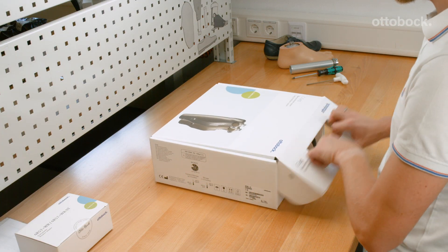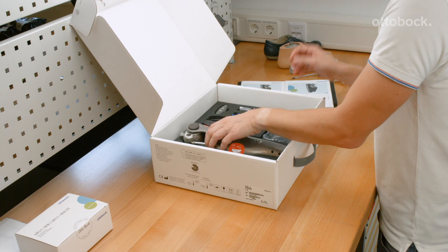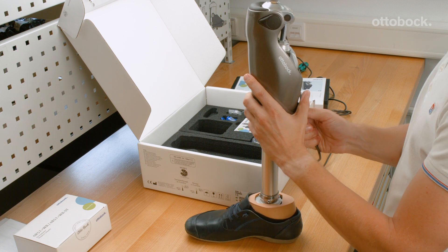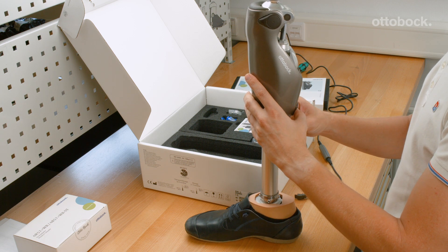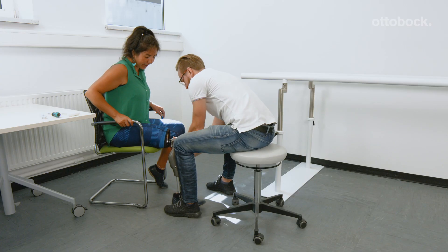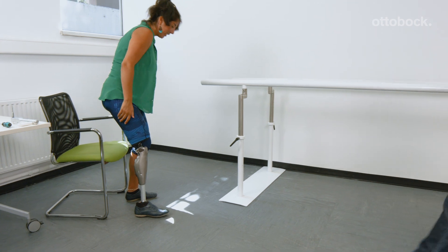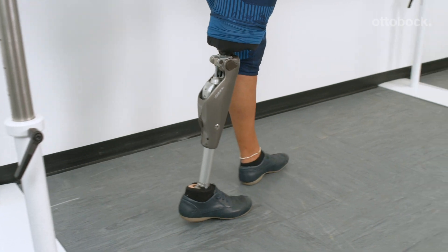Providing the best possible fitting for the user is the goal of every CPO as well as Ottobock. Our microprocessor controlled knee joints adjust their behavior according to the user data entered in the adjustment software. To support the CPO in providing an optimal fitting with the C-Leg 4, Genium and Genium X3, we have changed the factory default behavior of the knee joint. It does not release into swing phase unless the necessary user data has been entered into the adjustment software.